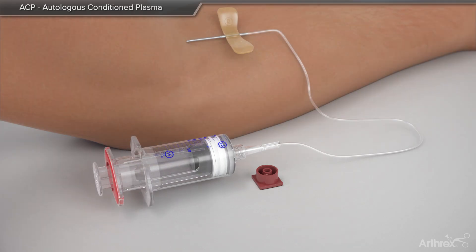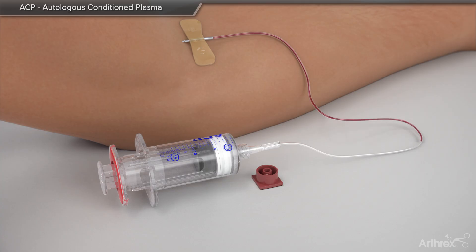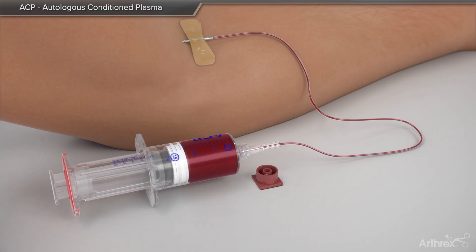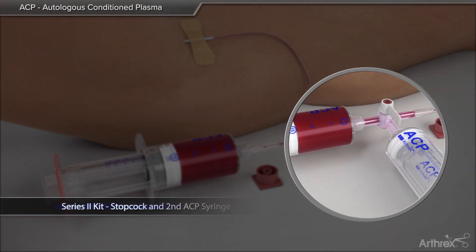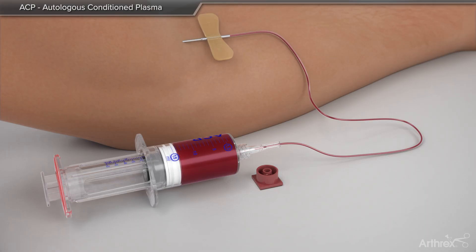A maximum of 15 cc's of blood is drawn by pulling back on the outer portion of the syringe. The Series 2 kit allows for a second syringe to be used. If ACDA is used, gently mix and place in centrifuge.